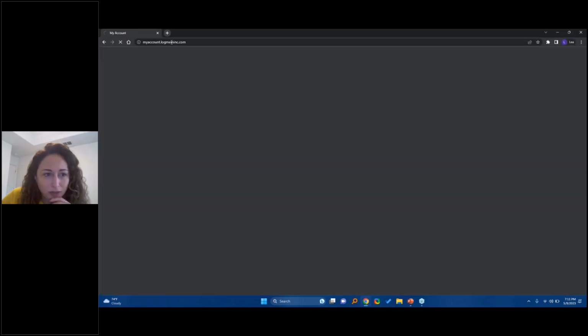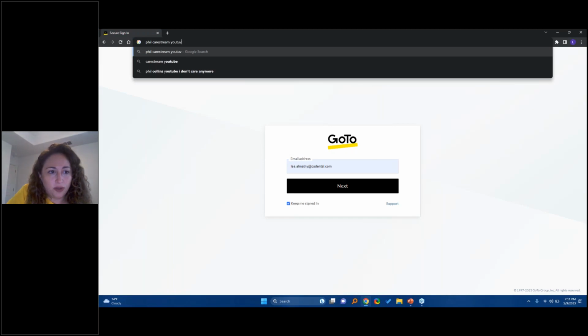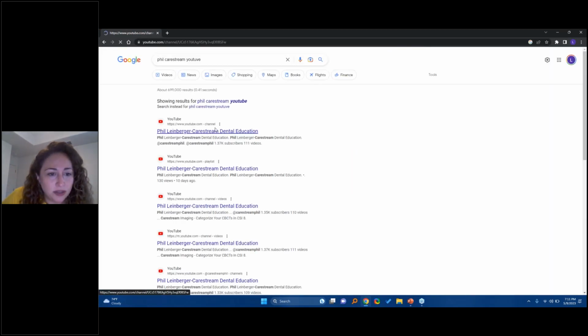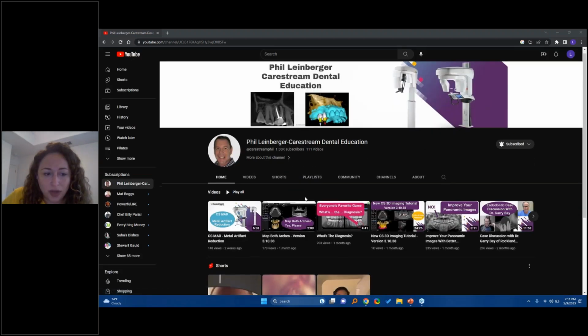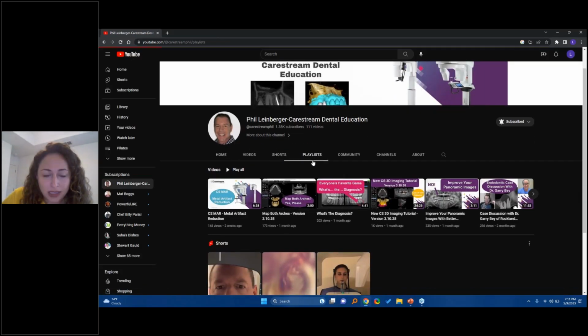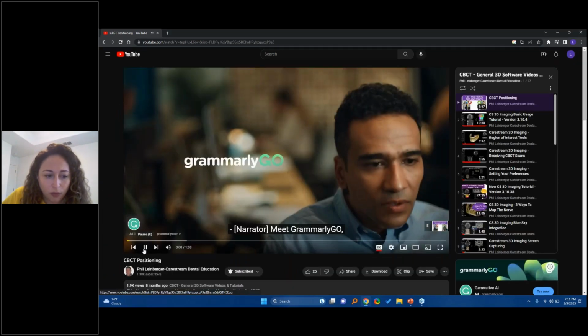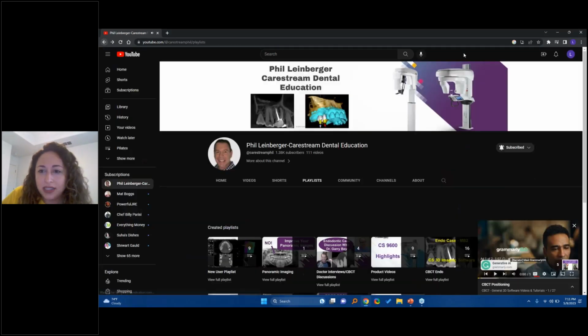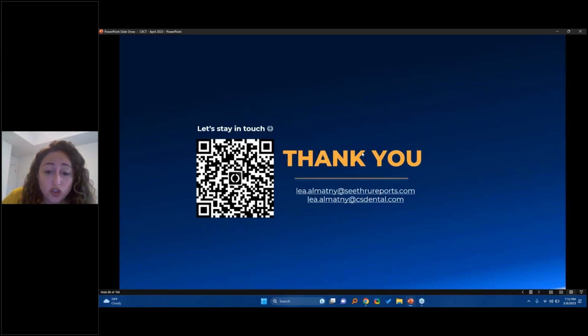I'm going to try to look up Phil Carestream YouTube to show you videos. There are videos, a playlist, for the CBCT general software. We're not going to play the video, but that's the video where you want to learn how to adjust your 3D rendering.